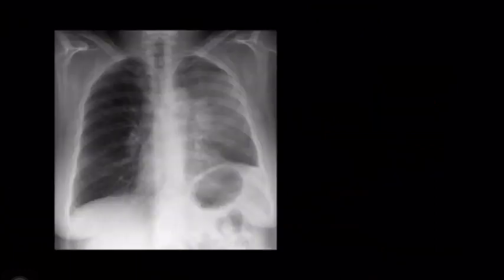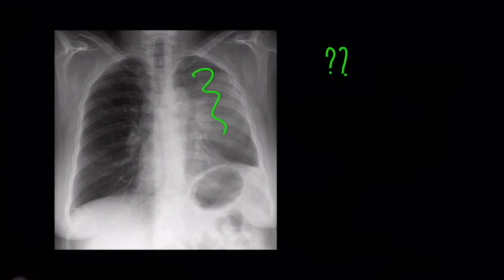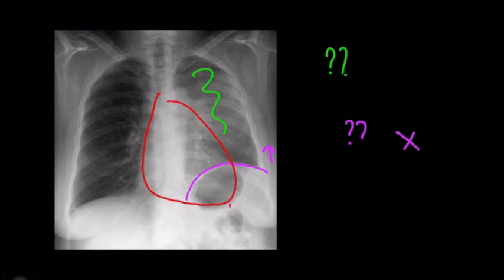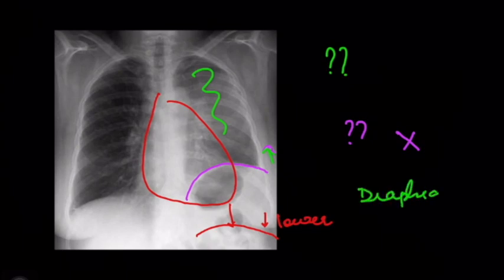In the next figure, there is an opacity and the left hemidiaphragm is at a higher level, which is not normal. We know the heart pushes the diaphragm down and the left hemidiaphragm is expected at a lower position than the right. This is pathological — displacement of the diaphragm, specifically elevation of the diaphragm, is another indirect sign of collapse.